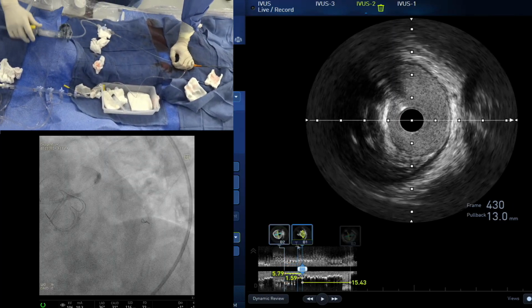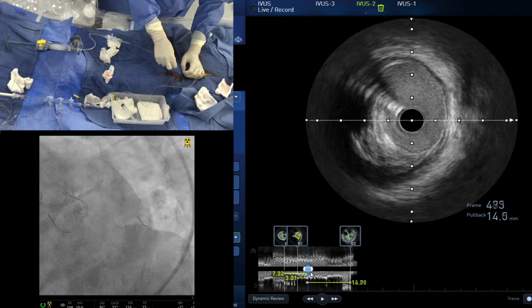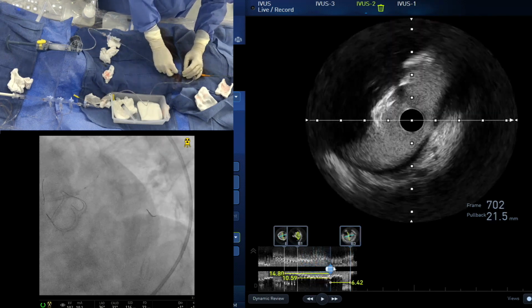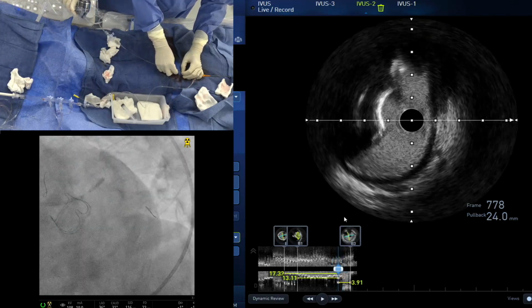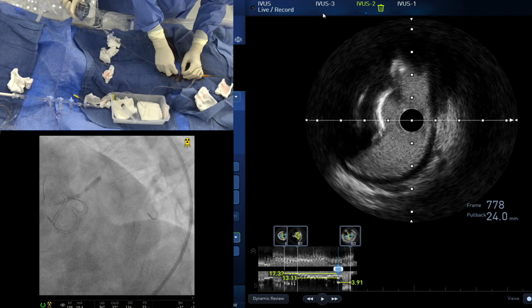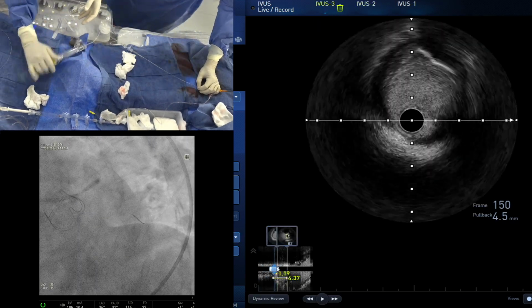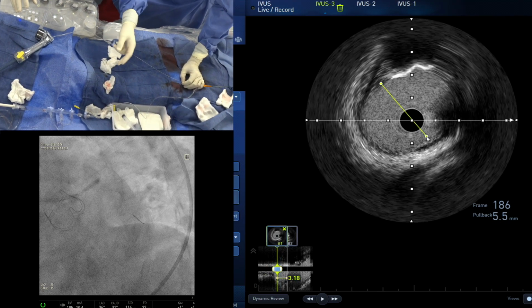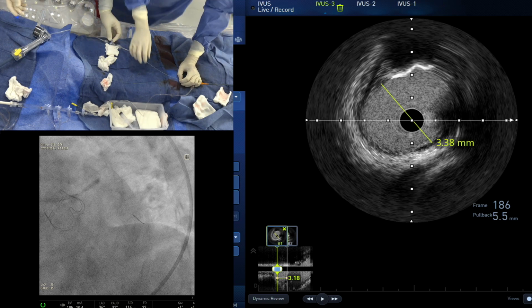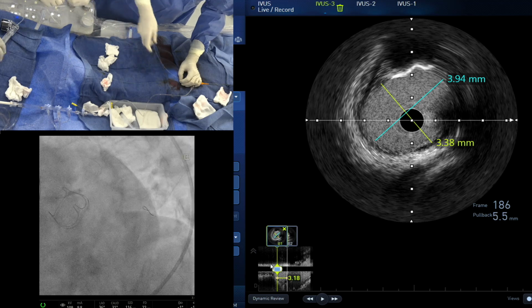The question is that even for the ostial circ, don't you like to dilate? Don't you like to dilate the circ also? Oh yeah, absolutely. Your question was for the circ, do we just go with the high pressure, or go to open NC, or go with the cutting balloon Wolverine. So we actually have a 3.0. Wolverine was our plan. Although I think the high pressure could have been good enough, we know that whether rota or cutting, it's steady in terms of MLD, but since we have it, we're just going to use that now.